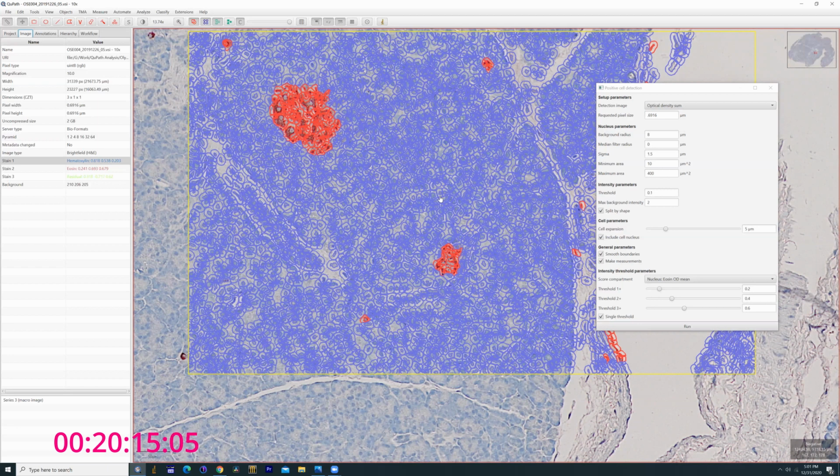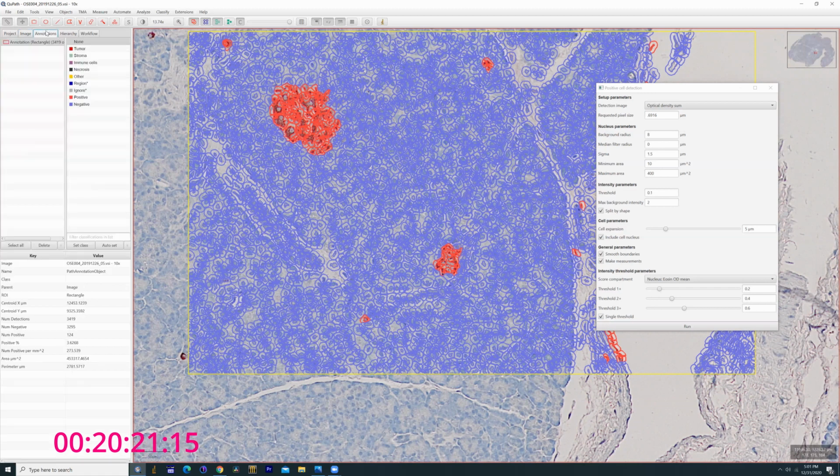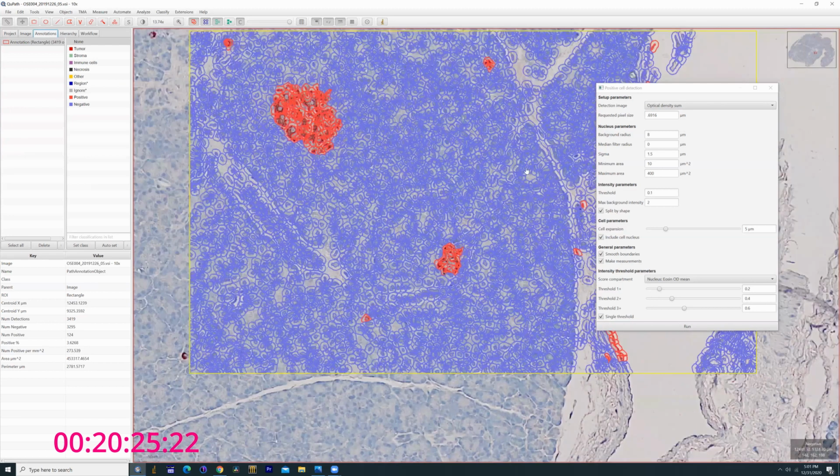This is basically the highest resolution. It takes a little more processing power, but it's the highest resolution at which the software, not the actual image, but the software, sees the image. This can fluctuate somewhat, and I'm not sure this is the best example, but the idea here is the lower you set this, the closer you make this, the more scanned cube squares we're going to generate to take in the entire image, and the more processing power it's going to take.